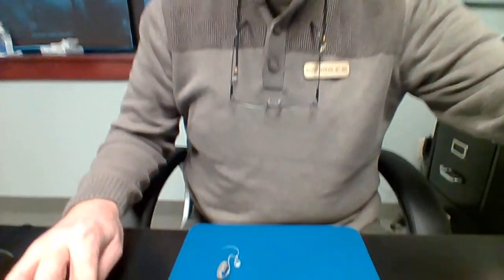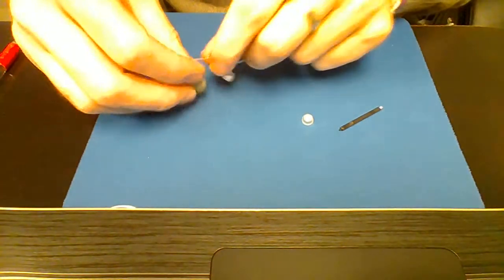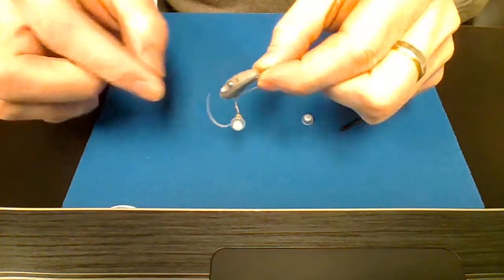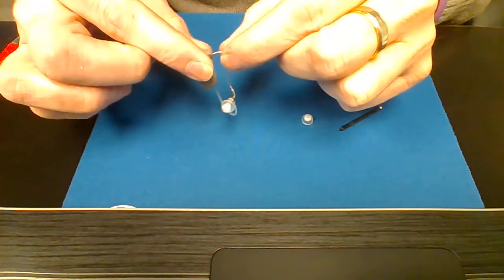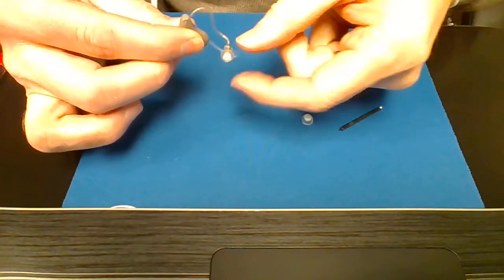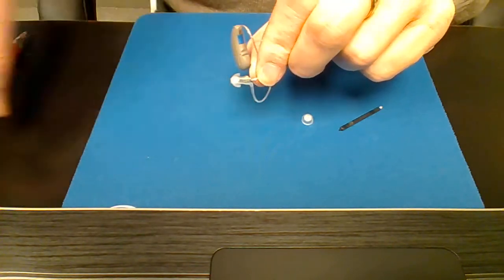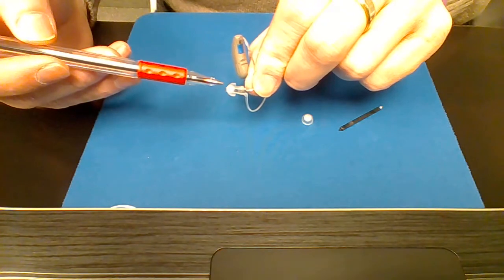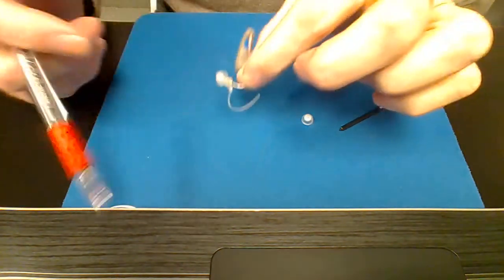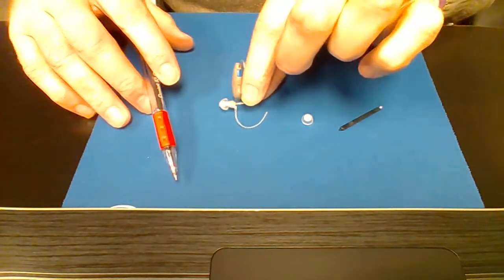Now you're going to need a few parts, okay? And first off, I'll show you the hearing instrument. This is it. There's a hearing instrument here, and then we have the receiver with the receiver wire, and it comes down to the receiver. The dome is right here, and the retention wire is here, and we're gonna replace these components.